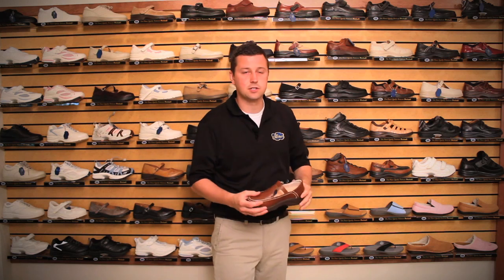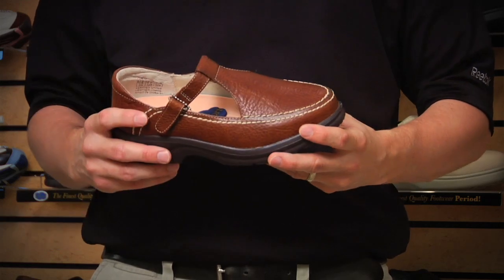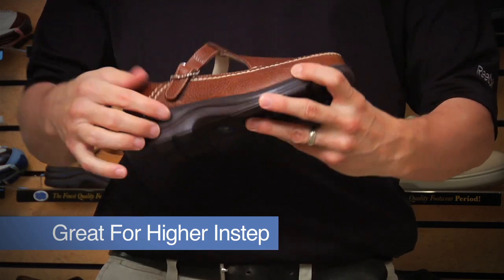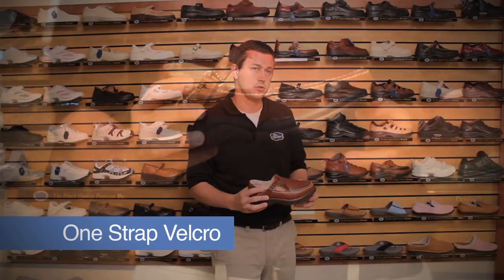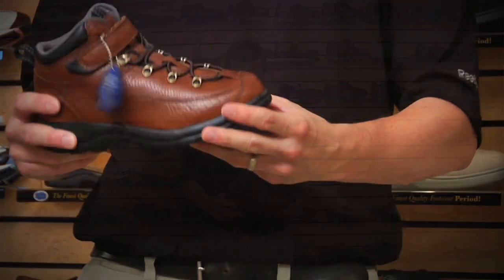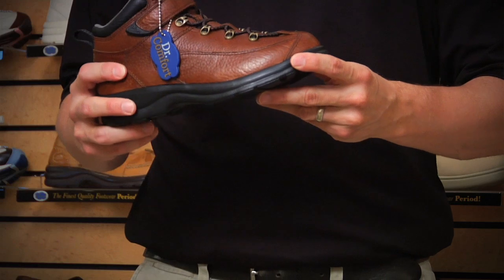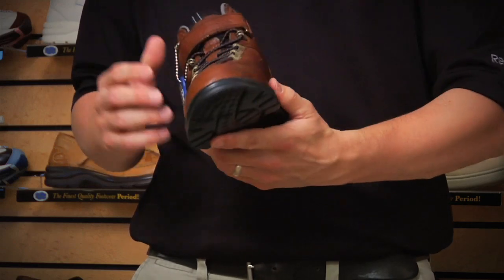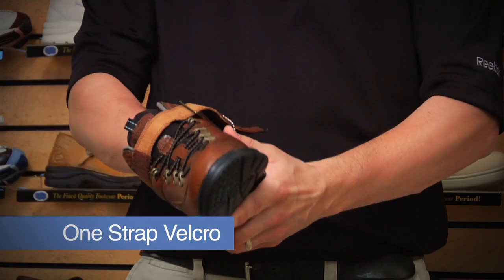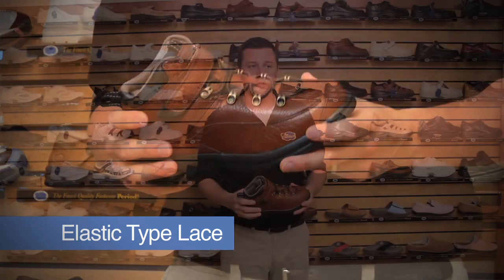Another shoe I'd like to highlight is known as our Lulu. The Lulu is a T-strap style shoe, which is great for patients with higher insteps, just due to the high nature of the shoe itself, with a one-strap velcro. For those patients with ankle instability or who like to go a little more rugged, we have the Vigor — more of an outdoorsy type boot. It is that one-strap velcro with the elastic type of lace, great for securing on the patient's foot and great for patients with ankle instability.